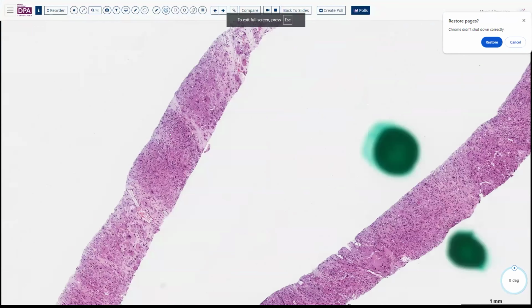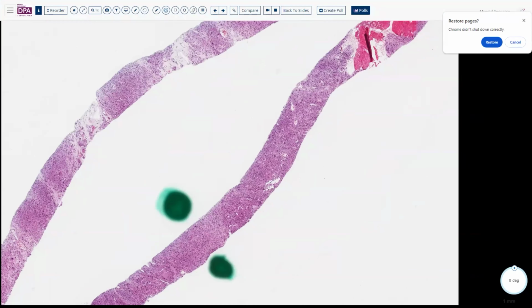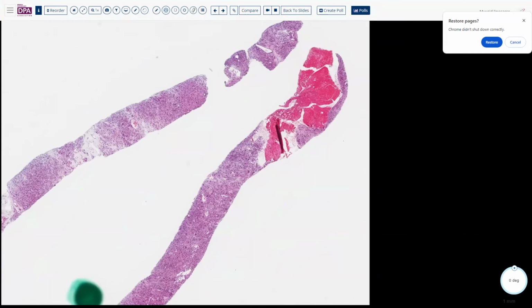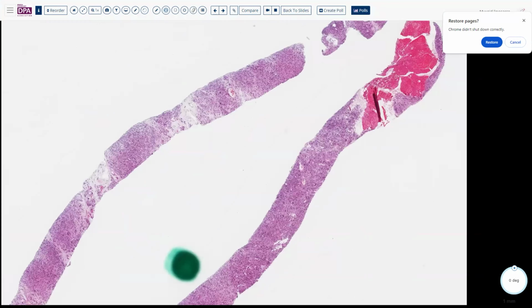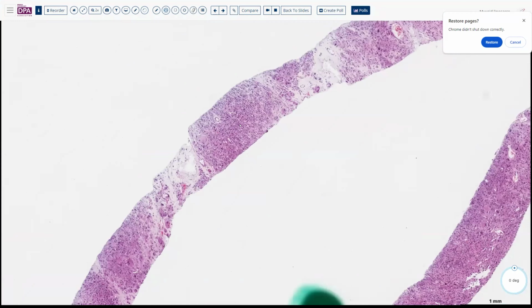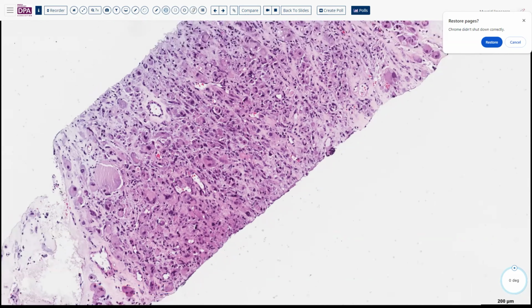So we'll come back to low magnification here again, let you see how this tumor is laid out. We've got some vasculature, a lot of high cellularity, some low cellularity areas, no specific structure to the tissues other than this single cell, somewhat infiltrative pattern with intervening vasculature and fibrous tissue.